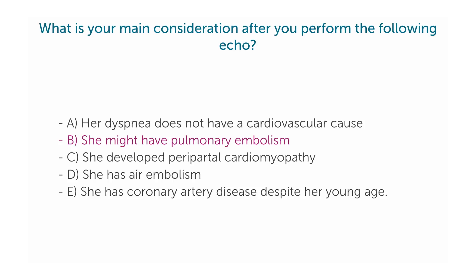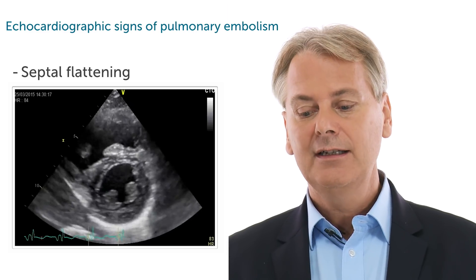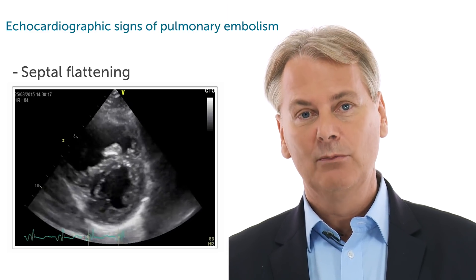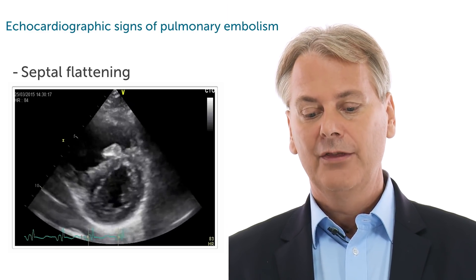The correct answer in this young woman, of course, is she might have pulmonary embolism. Let's take a look at the echocardiogram again. When you take a look at the short axis view, you will see an abnormal motion of the interventricular septum.